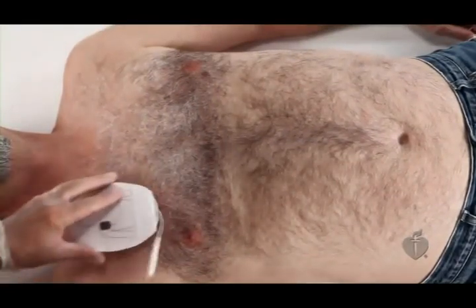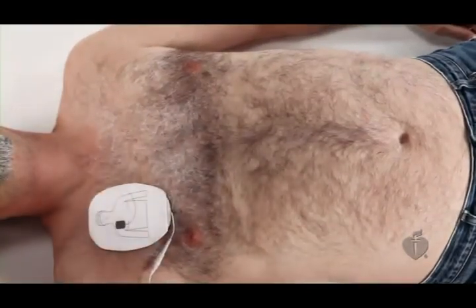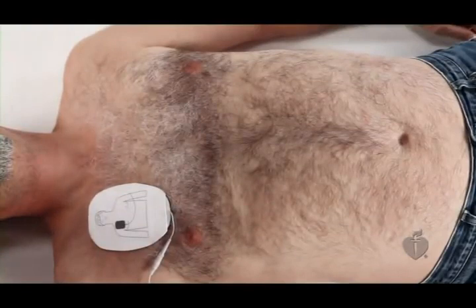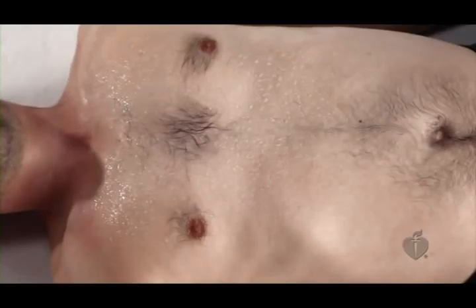If your AED supply kit has a razor, you can use this to shave the area as well and then reapply a new set of pads. Water on the victim's chest could allow the shock to travel through the water between the pads and prevent delivery of an effective shock dose to the victim's heart. If someone is lying in water, you should quickly move the victim to a dry area.